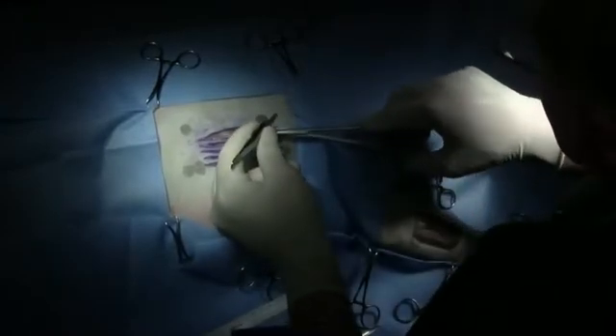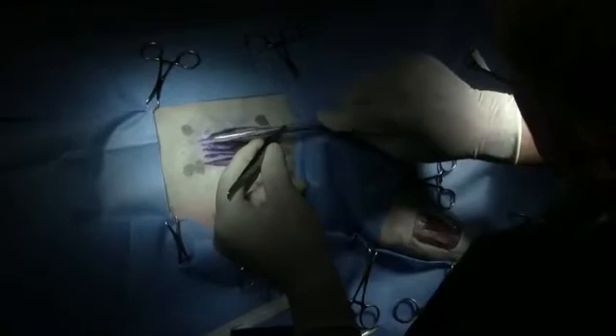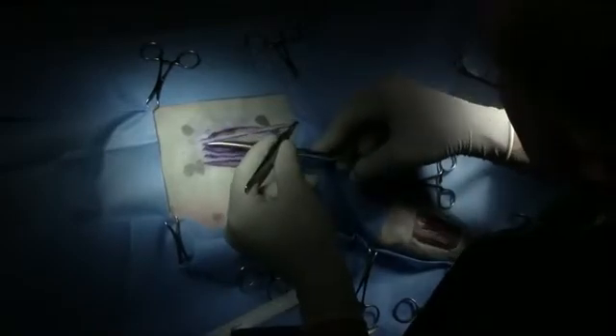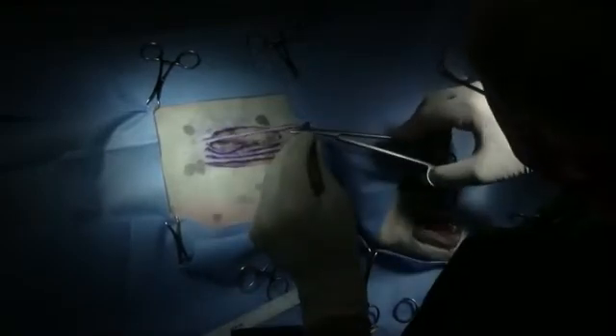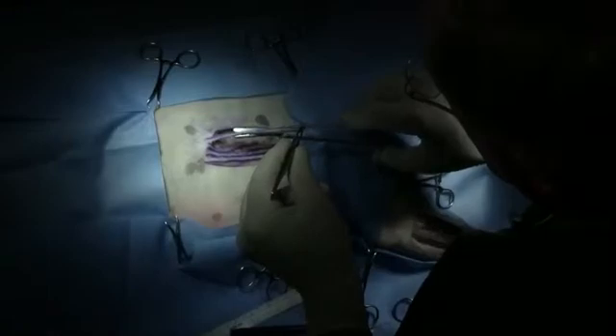The easiest way to get that off is to leave it attached at one end, take some thumb forceps and grasp that graft, pull it up, and you're cutting it loose here. Now we don't have the subcutaneous tissue off of that yet, but what we'll do is put some stretch on that graft and then we can go down the back side of it with our scissors, as we're doing here, and remove that subcutaneous tissue. And that's important for getting this graft to heal.